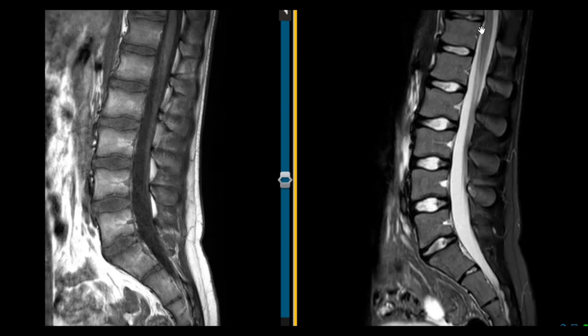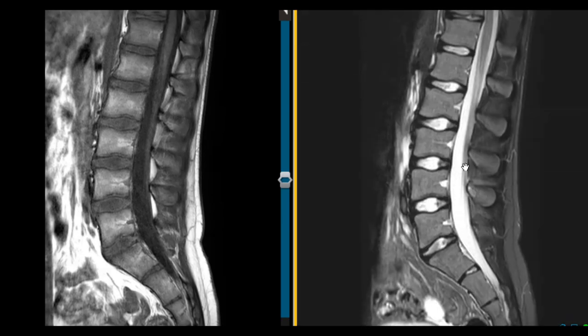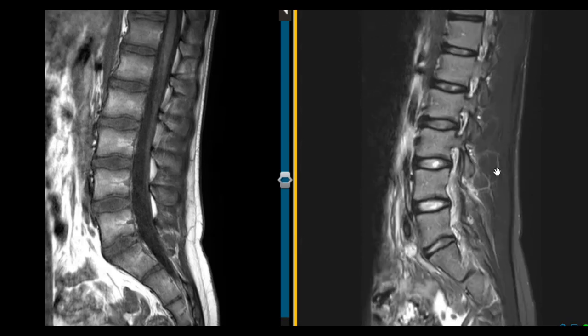The spinal canal is this area back here; it's filled with fluid, which is white. And then in the back here we see these spinous processes. Now there are bones that bridge the vertebral bodies in front and the spinous processes in back.